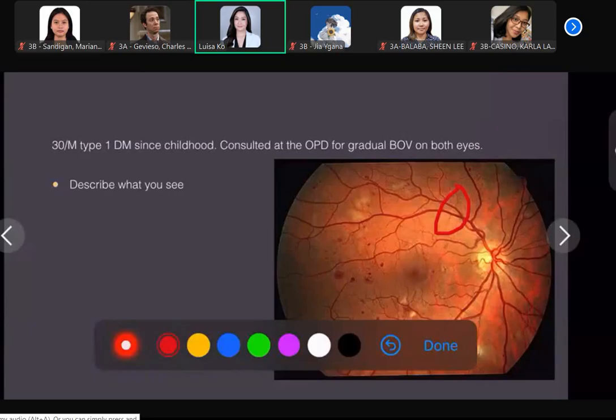That's the branching we should take a look at. Fundus photo of the right eye seen through clear media shows us a yellow disc with distinct disc borders, CD ratio of about 0.3, AV ratio, I still say it's about 2:3.